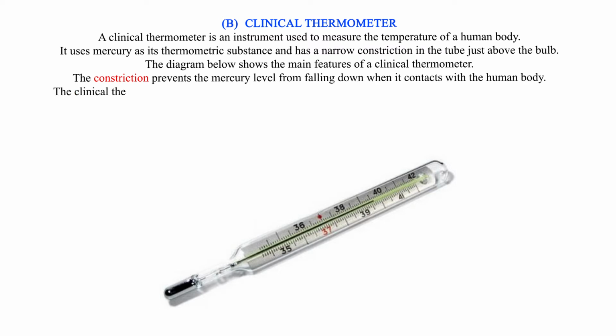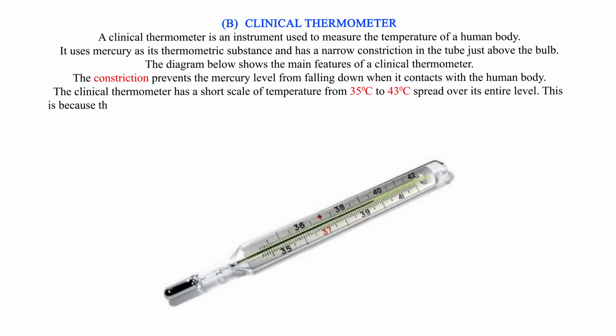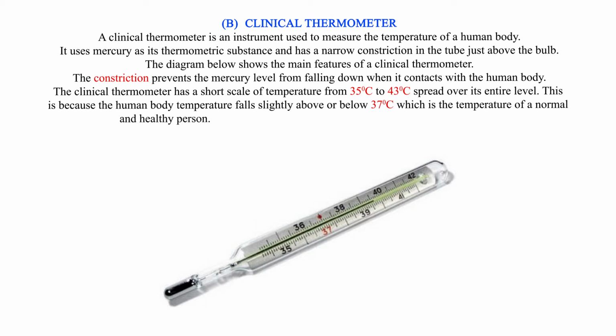The clinical thermometer has a short scale of temperature from 35 degrees Celsius to 43 degrees Celsius spread over its entire length. This is because the human body temperature falls slightly above or below 37°C, which is the temperature of a normal and healthy person.